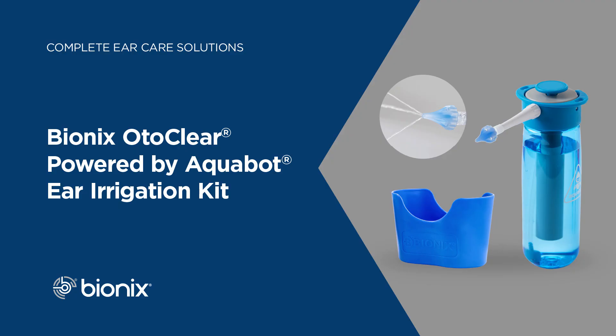The OtoClear tip has a luer fitting on it, so it fits on any luer or luer lock syringe or fitting. There are several water delivery systems for the OtoClear tip.